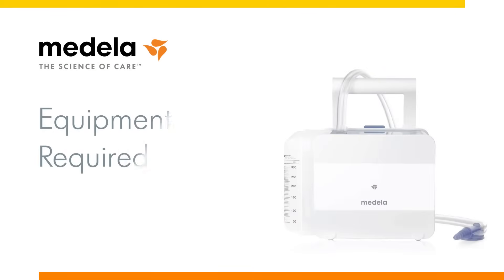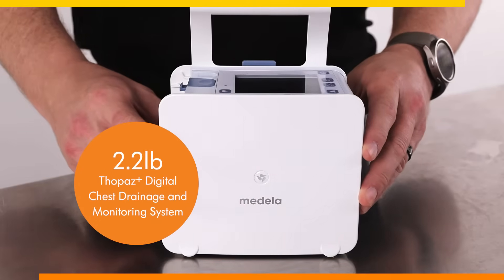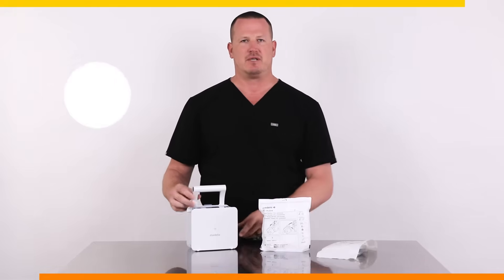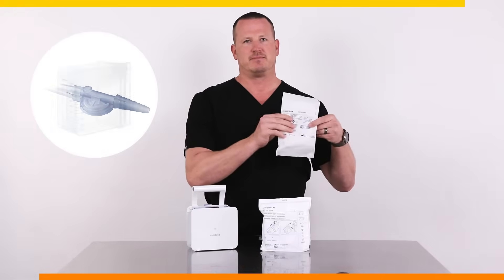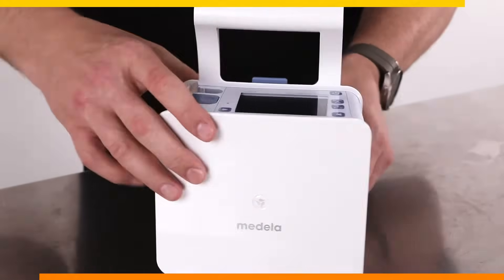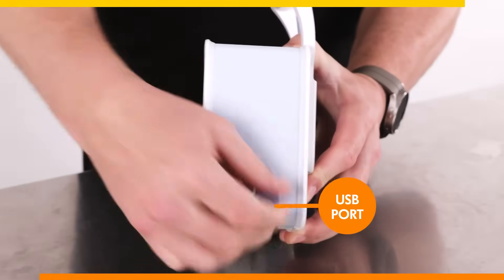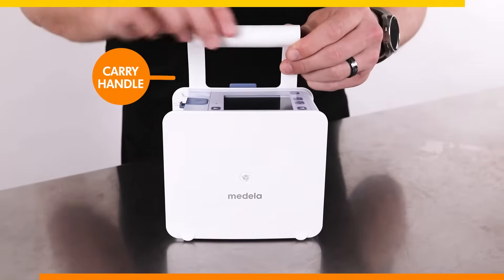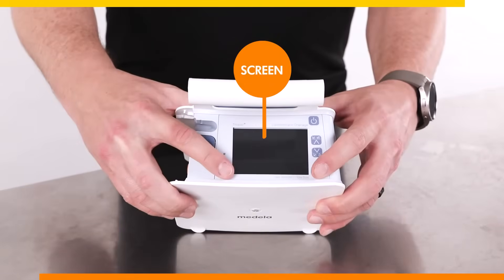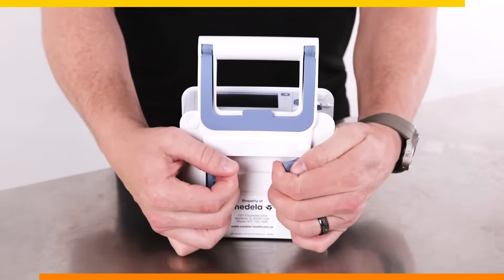Let's review the equipment required for setup, which includes the reusable 2.2-pound Topaz Plus digital chest drainage and monitoring system and the following consumable items: the tubing and the canister, which will attach to the right side of the device. On the left side of the device are two ports, the power port and the USB port. On the top of the device is the carrying handle with the bed holder, the screen, and multi-function operational buttons, and on the back you will find two rail holders.